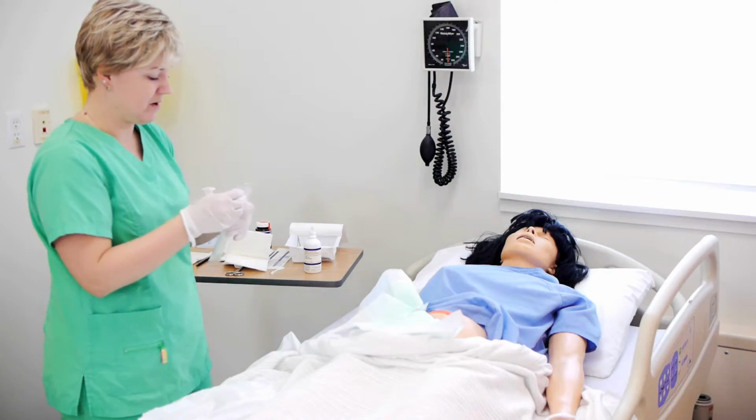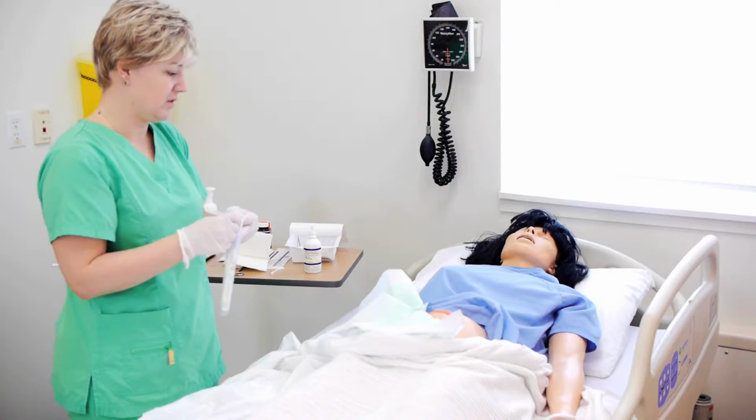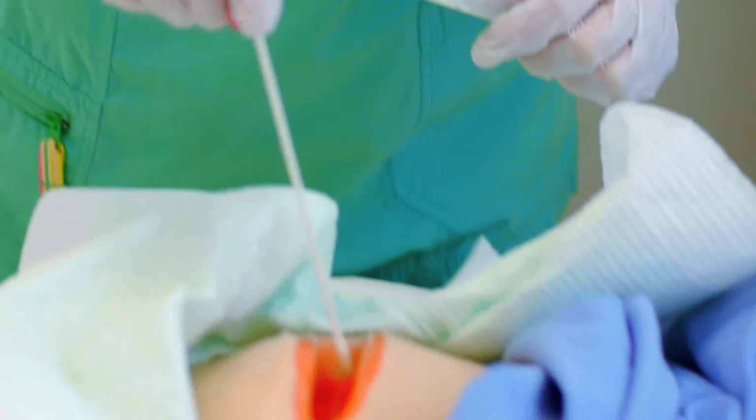So I'm going to take a swab of your wound. It shouldn't be painful, but I do need to apply pressure at your wound bed. We're going to take a swab of the cleanest part of your wound bed.